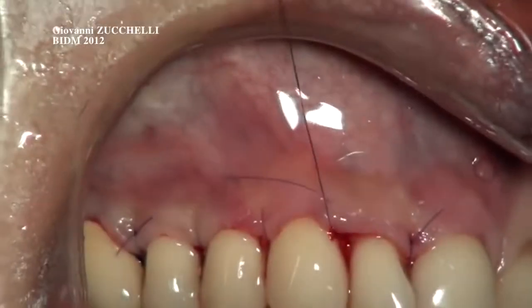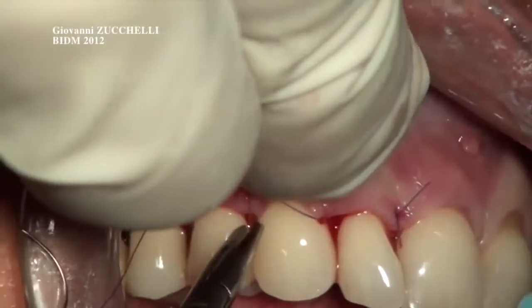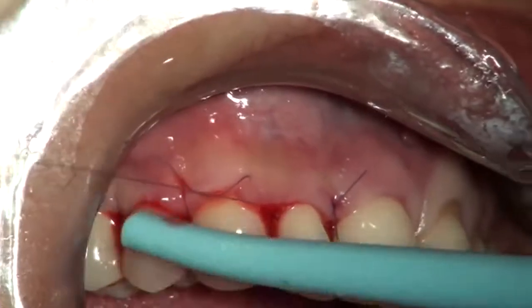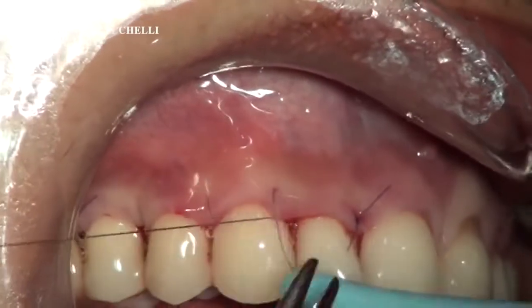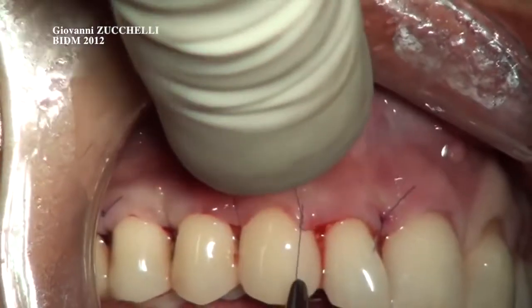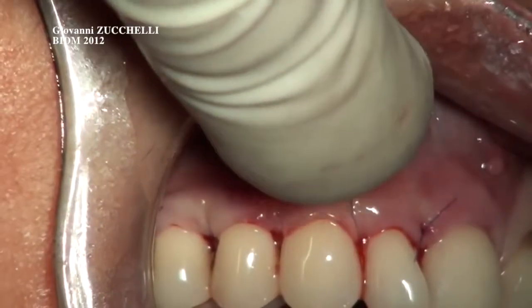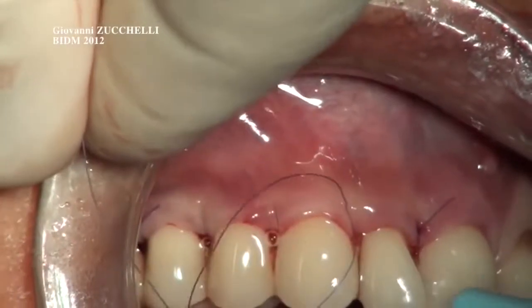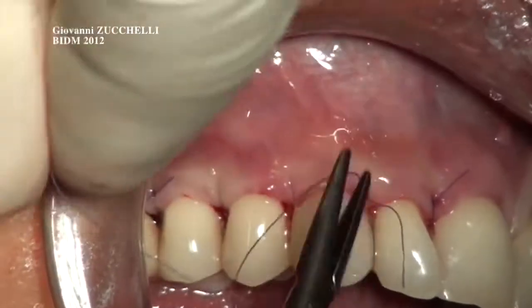Okay, and now before closing this, okay, now it fits, right? I'm going to close the last one in order to optimize adaptation of the surgical papilla above the anatomic papilla.